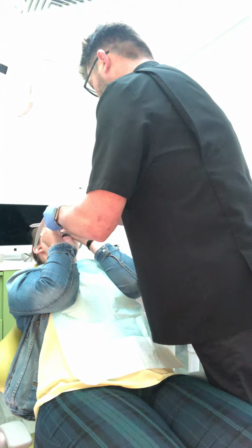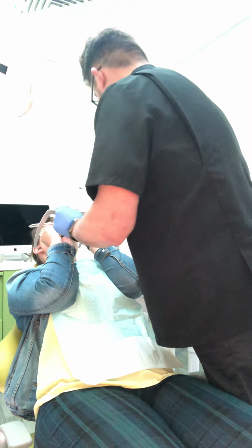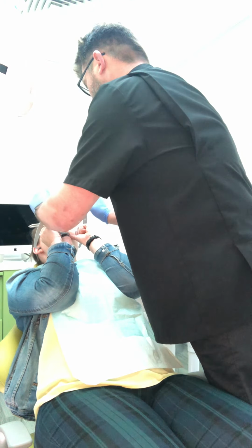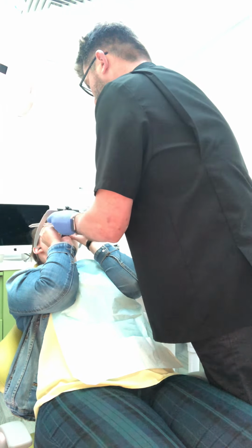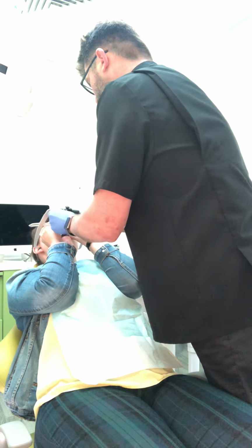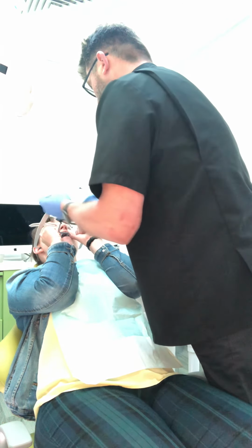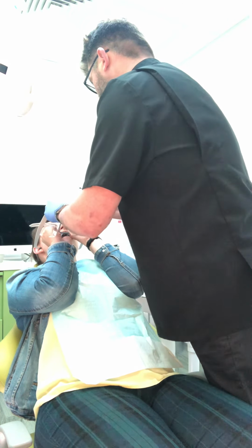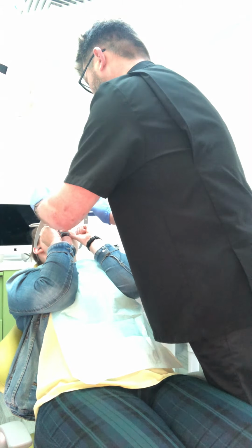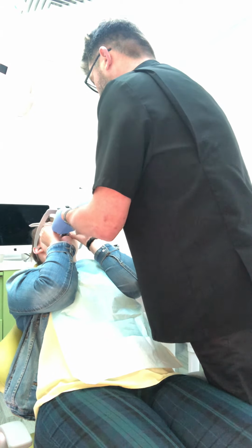And now I'll do universal joint number 2. And as I tighten, I'm just checking again, making sure we're nice and, you went bullseye then, making sure we're nice and level with the IP line still. Perfect. Until that's fully tightened, both sides. Great.